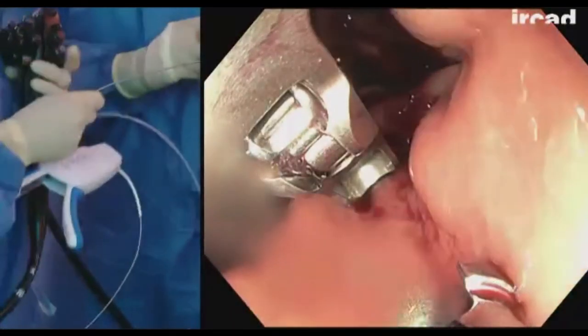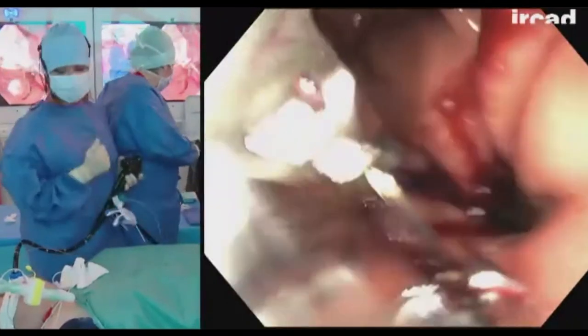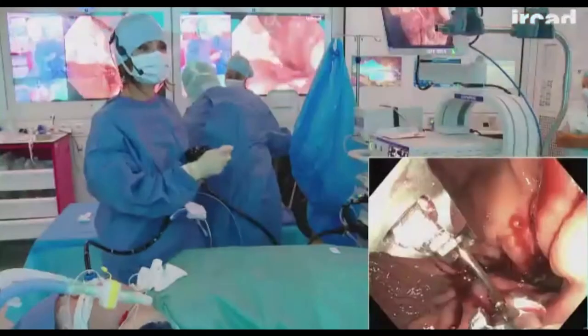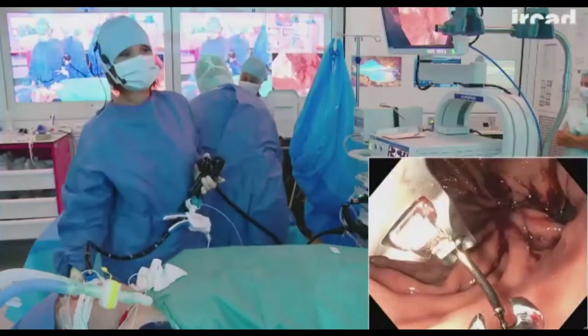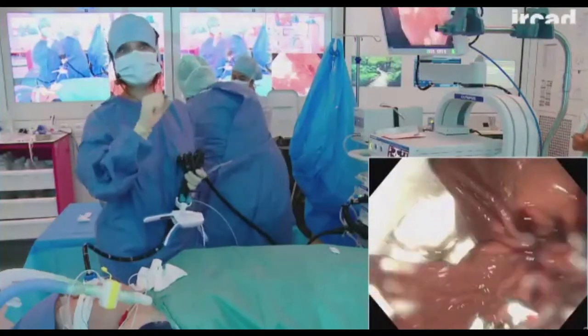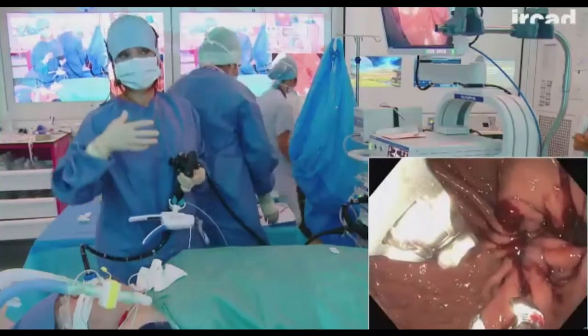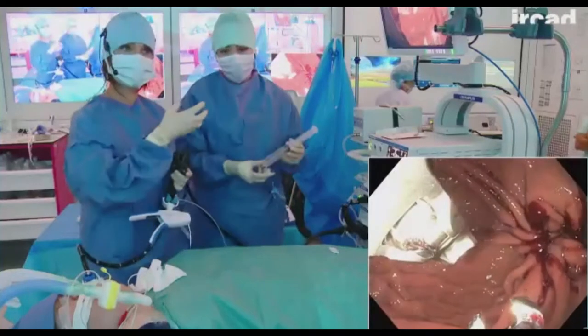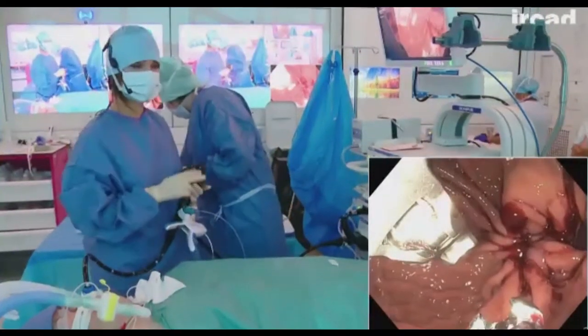I say very gently because Manuel witnessed this event live. If you are too enthusiastic and you close very strongly, what's gonna happen is that you're gonna cut the suture, or worse, you're gonna fix the cinch into the mucosa with the old metallic wire. So you want somebody who's very delicate and can feel the pressure already done. So I'm gonna put another stitch.